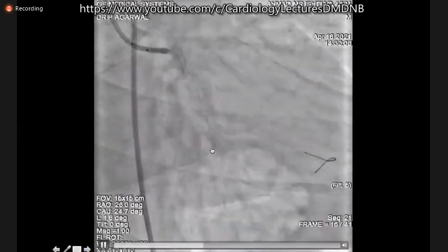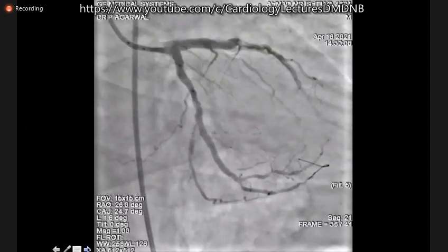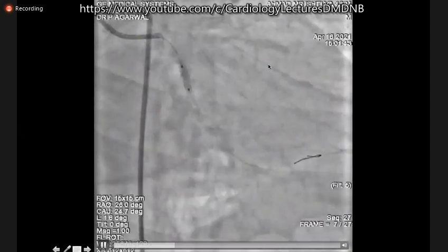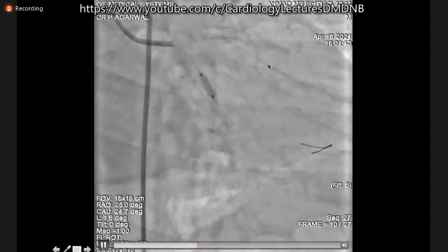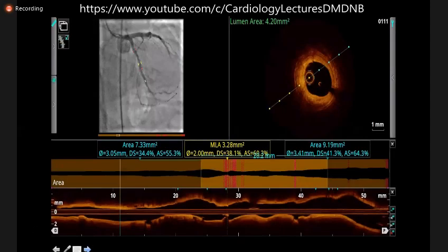You can see some cuts here in the distal part of the lesion. Went ahead again with the cutting balloon, slightly more aggressive, about 18 atmospheres and a different direction of cutting. And now it's a good cut made. Now I've taken a picture with an OCT. Just have a look.